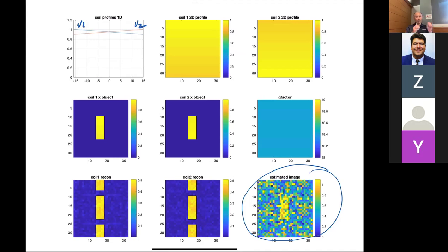And so it sort of ping pongs between those two aliased voxels, and that's why you get this really noisy image. So hopefully you will get something similar on your homeworks. I think that last homework problem is more of a guided experience. You sort of plug and chug and just comment on what you see.